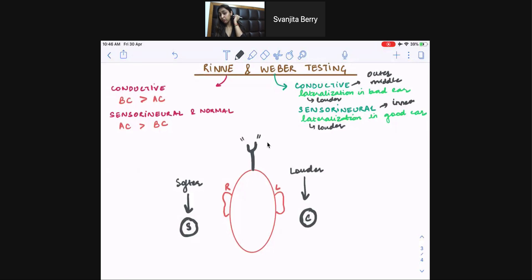Once they stop hearing the tuning fork, we remove it from the mastoid process, and we hold it up in the ear, up in the air, close to their ear. And that represents air conduction. If they continue to hear it in air, that means air conduction is longer than bone conduction, if they continue to hear it in air.